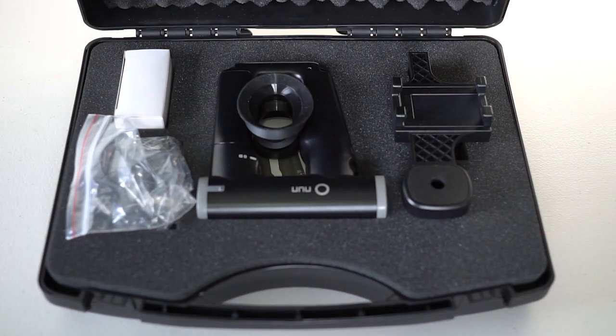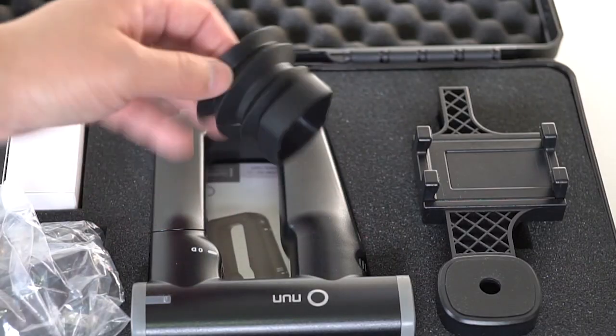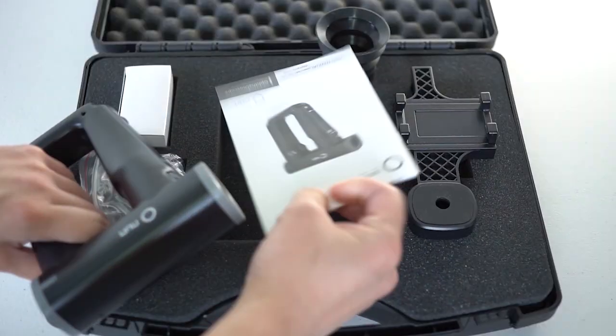In the box, you will find an Odox Nun ophthalmoscope, a universal smartphone adapter, an eye-cup, the charger, and the instruction manual.